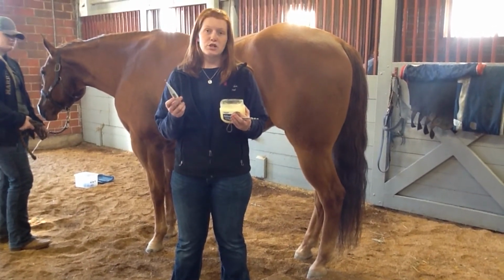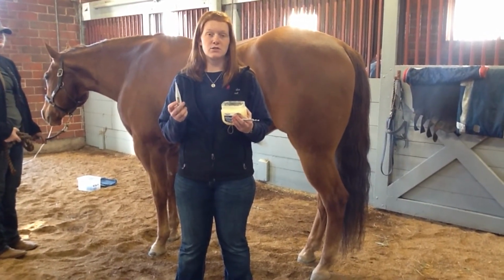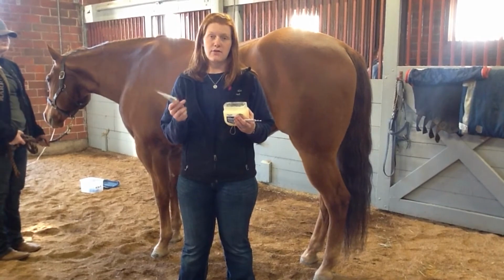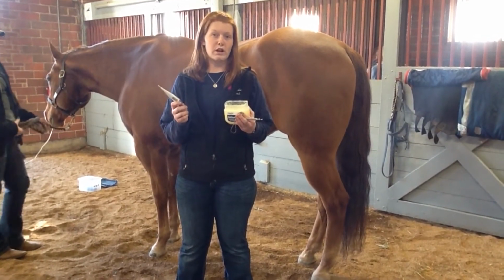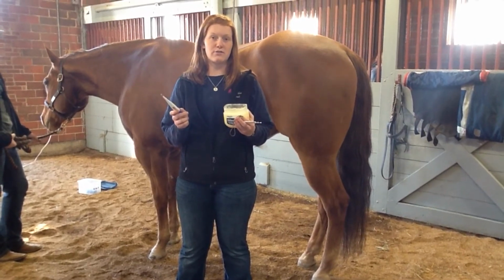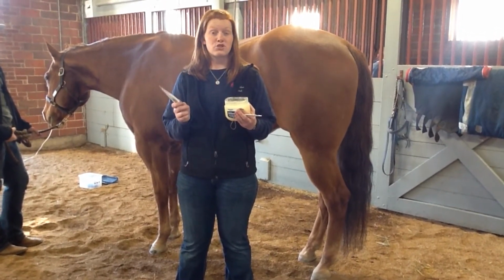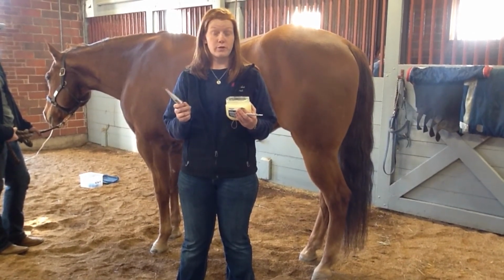The one thing that I do want to note is that your digital thermometer does run a touch lower than your mercury. So if your digital temp is running high on the scale range, which the average range for a temperature is 99.5 to 101.5, with your average being 100.4.